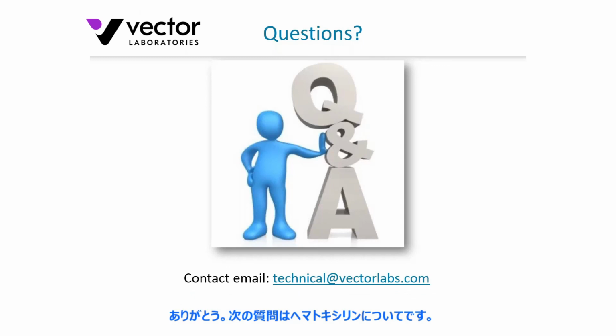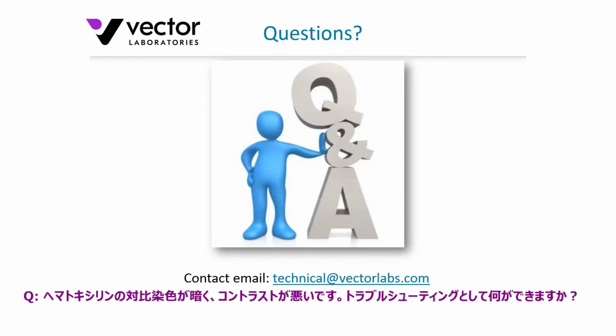The next question is about hematoxylin. My hematoxylin counterstain is very dark and shows poor contrast. I've already decreased the incubation time down to 10 seconds. What else can I do to troubleshoot? Wow, okay. Certainly the concentration may factor in as well.